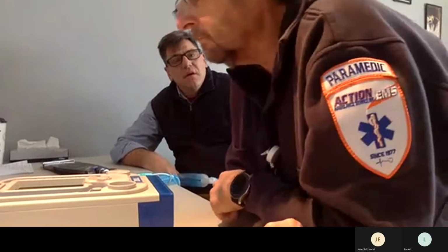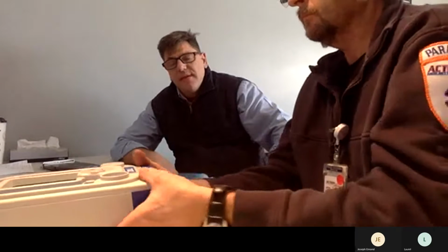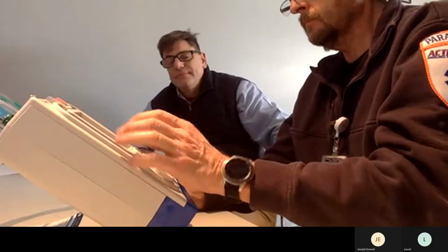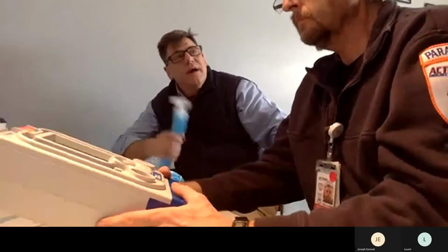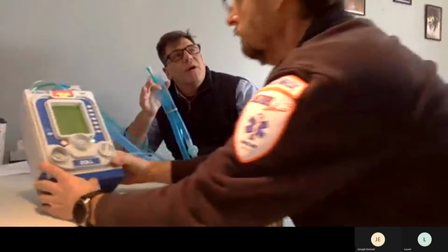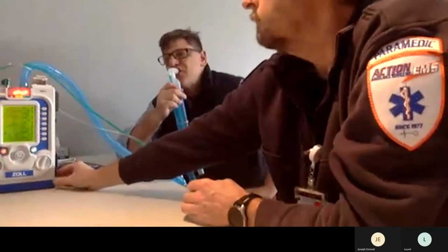At the very top, it says adult, and we're going to mask an adult. So please hit the green check. And at the very bottom, we're in AC mode, yes? Change that AC mode to CPAP. Okay, we'll start breathing on the vent. I want you guys to yell out what my volumes and pressures and rate are.